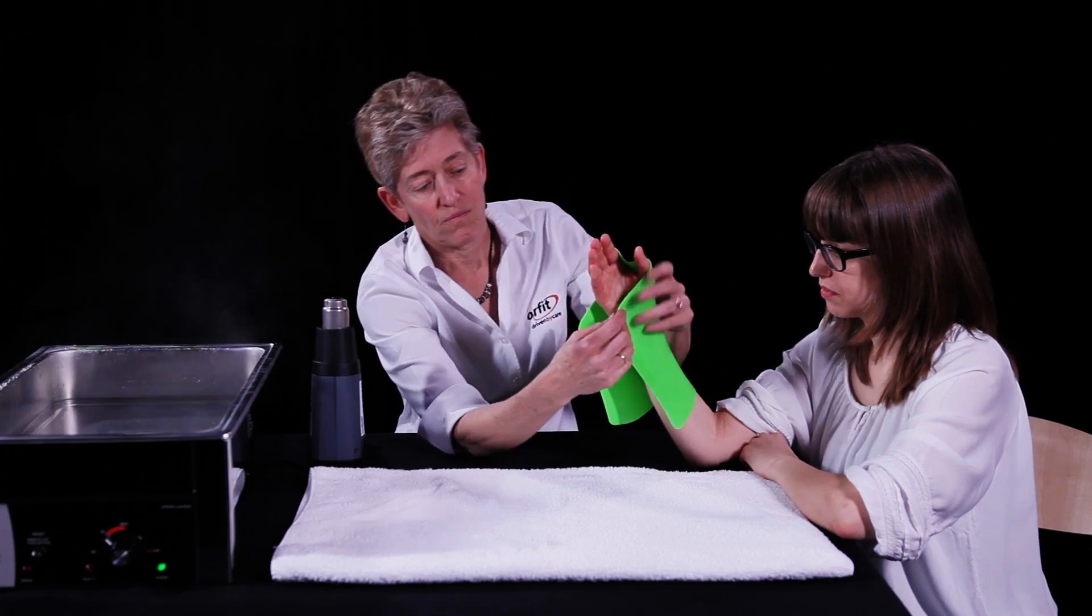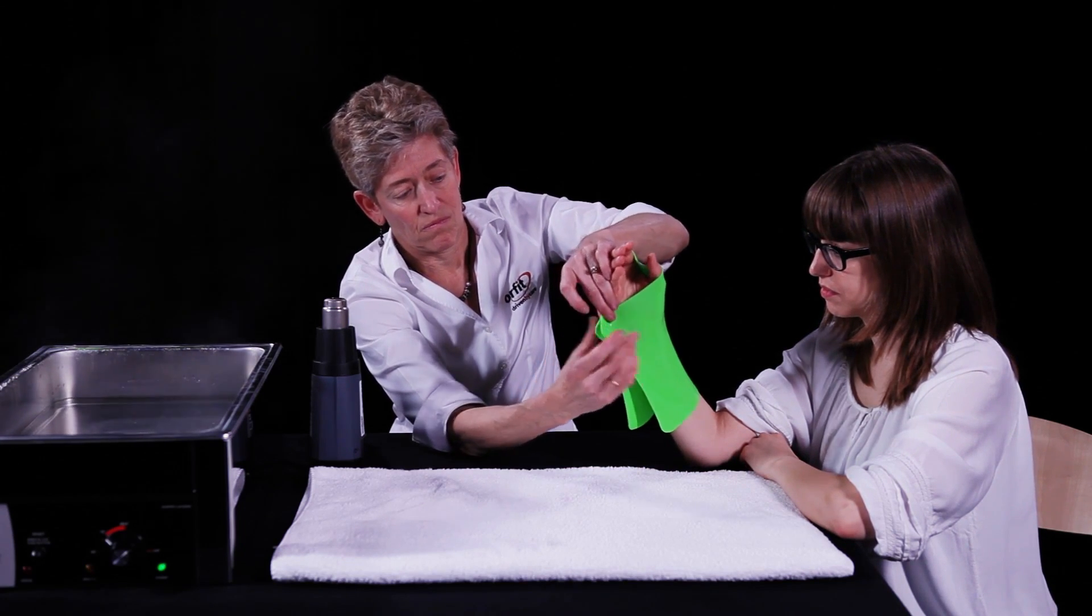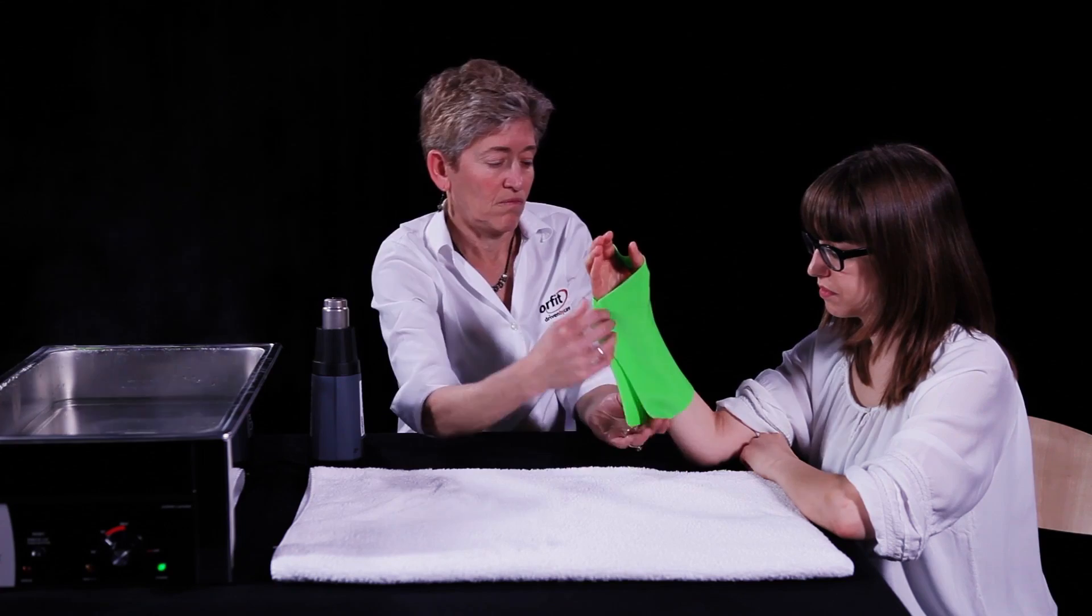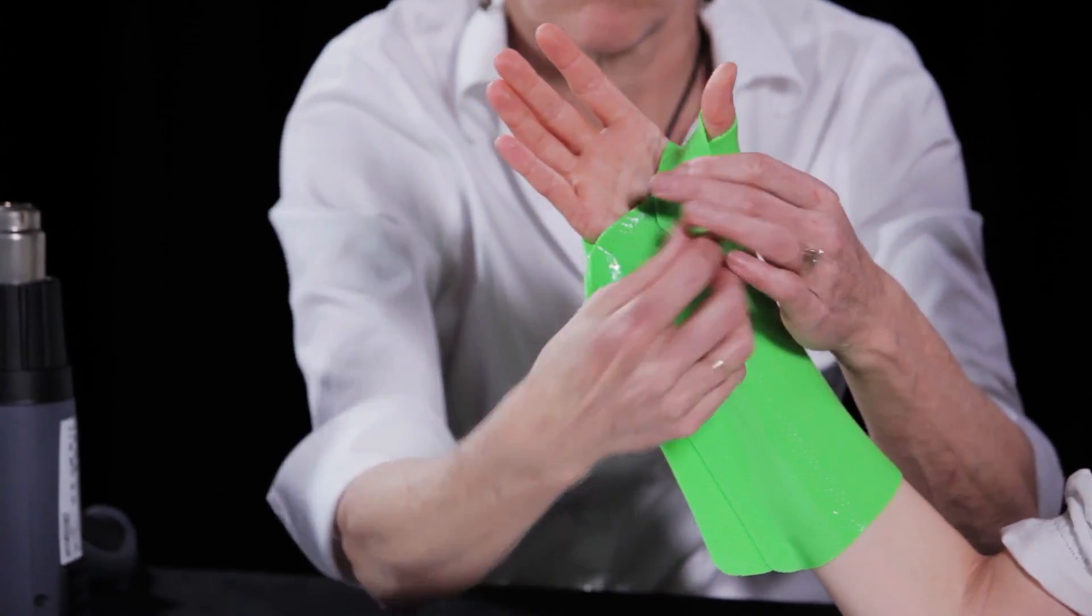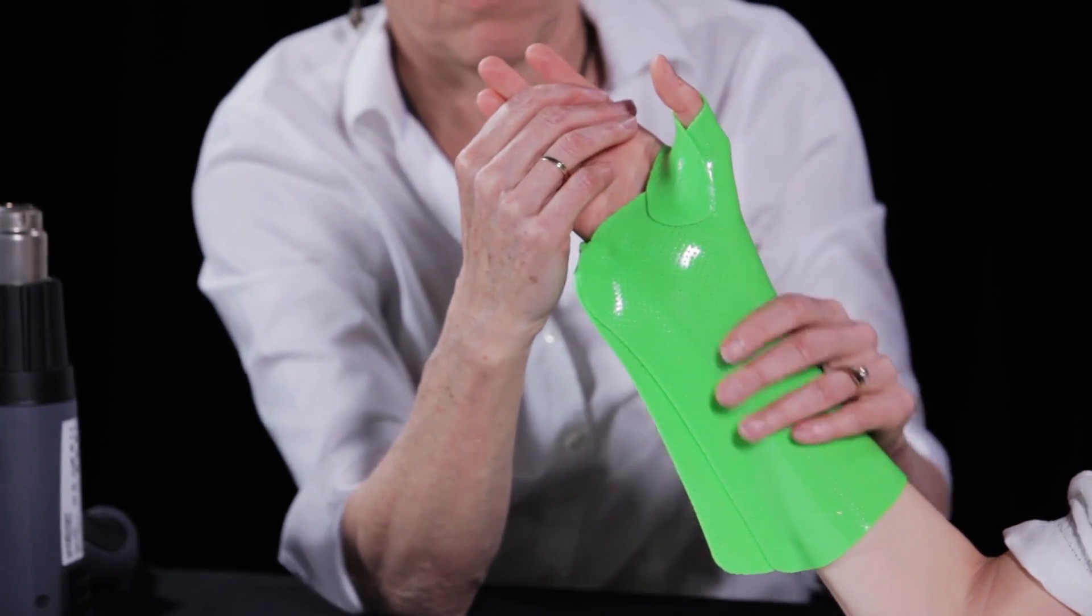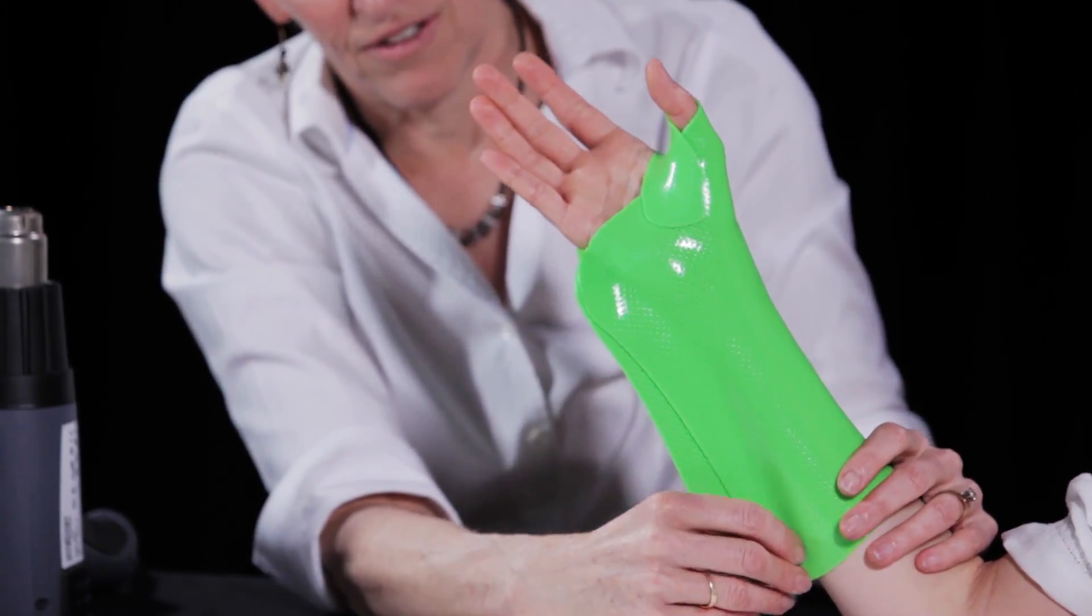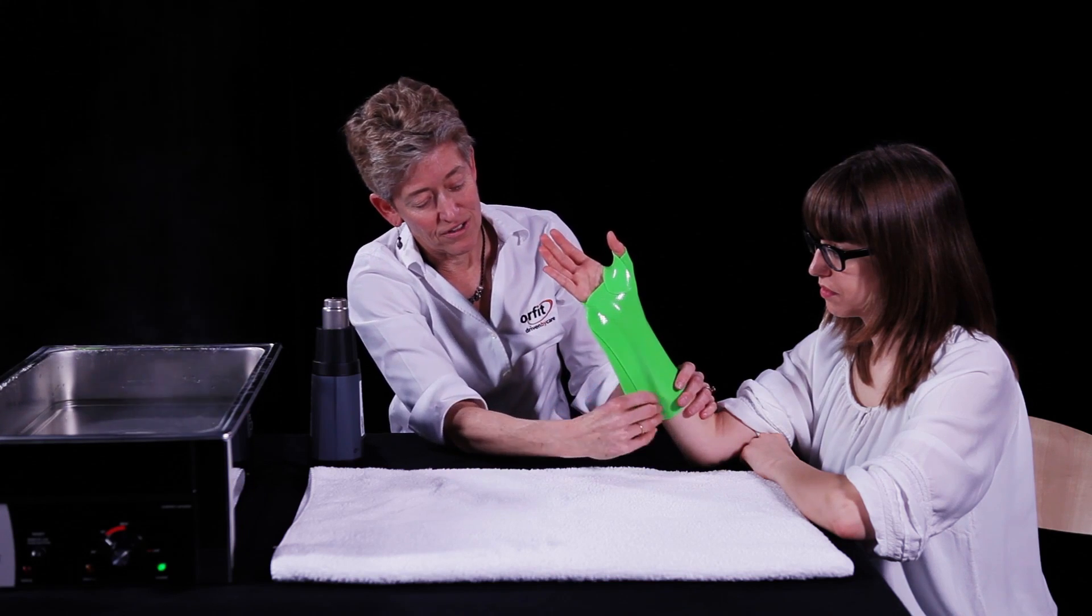Lift the patient's forearm and stretch the material so that it conforms around to the ulnar side of the hand and forearm. Pull the pre-cut tab through the first web space and attach it on the volar part of the thenar eminence, aligning the thumb in slight abduction and opposition.